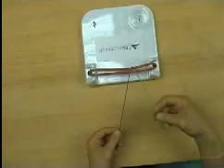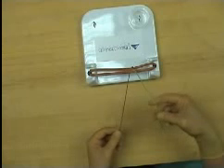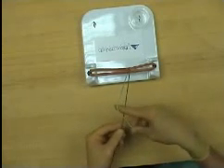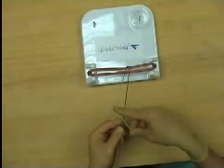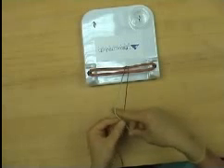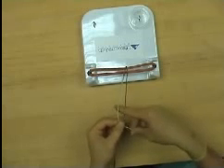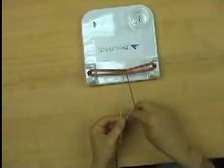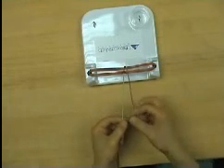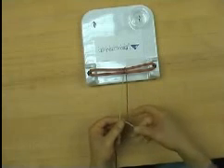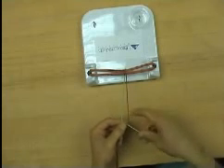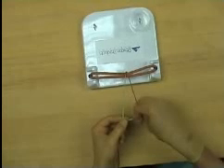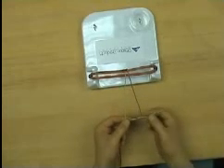Begin by crossing the right thread over the left and form a figure 4 shape by extending the right forefinger. At the crossing point, grasp both ends with the left hand and form a half hitch by twisting the right end under the left. The end of the right thread is held again and the action repeated to create a double half hitch.